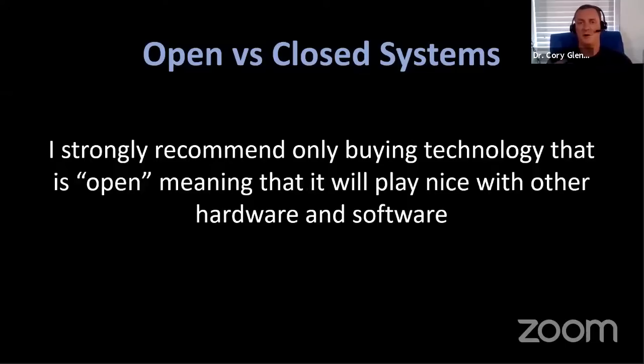And yeah, if you're all in and you buy the entire Cerec system, it's excellent. It works really well. They've done a great job of simplifying that whole workflow. Again, it just comes at a premium cost. So it's a matter of opinion here, but I am very much to the side of the spectrum that recommends using open source stuff, because I just don't see that the cost savings are there anymore for trying to do all your lab work in-house at those really high prices.